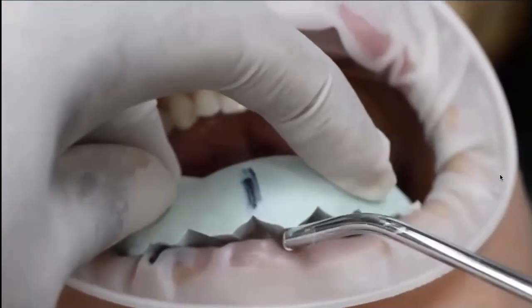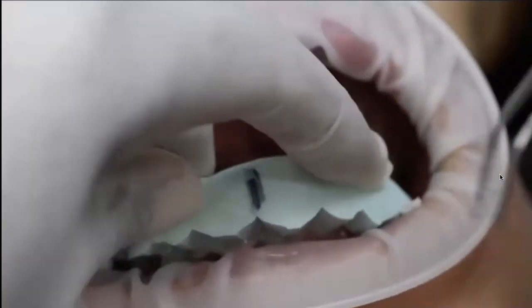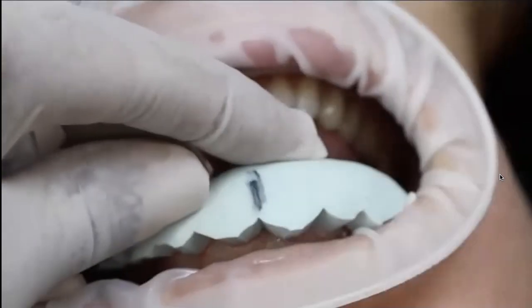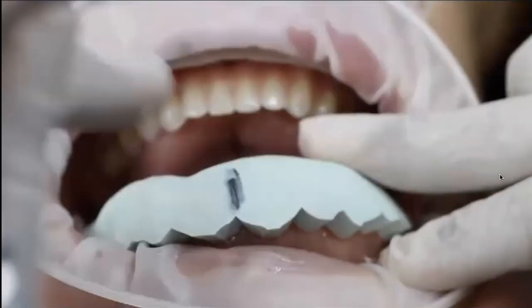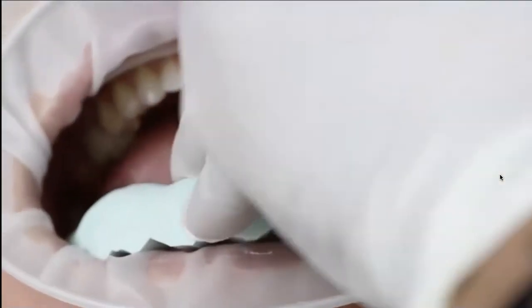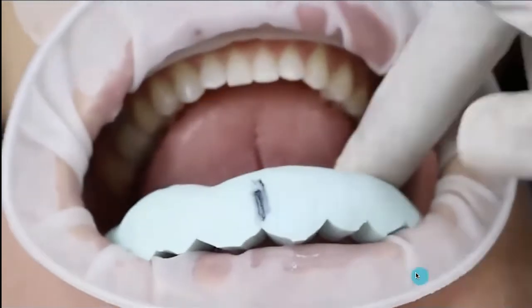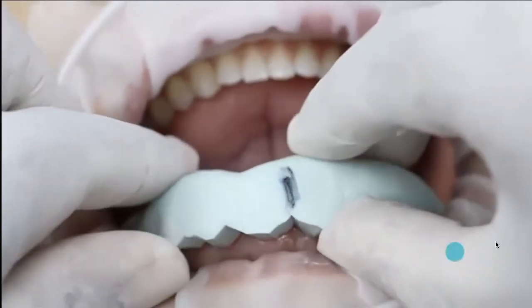So you place the dental wax-up. I'm not going to go over the details on how to do it here, but make sure to cut the silicone key following the patient's gingival margin, the cervical margin of your design. That way, once you remove it, it will look much nicer and will be much simpler for you to show it to the patient and make the workflow much faster.